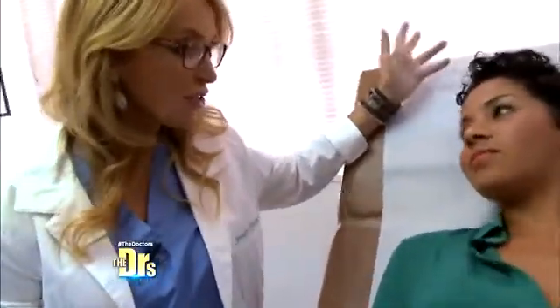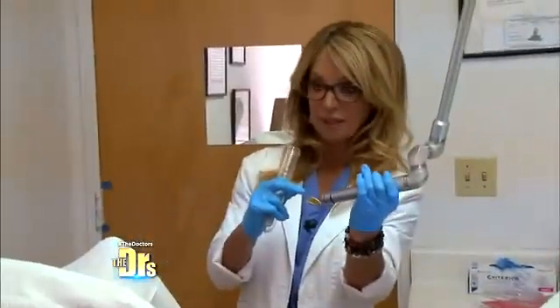How have you been feeling? I've noticed less of the urination coming out, so that's a good thing. So when you're running, jumping, exercising, not leaking? Not leaking, no. I'm going to insert the probe. We're going to go in a circumferential fashion, all the walls of your vaginal opening. This is the actual laser that comes out like there. Okay, here we go.